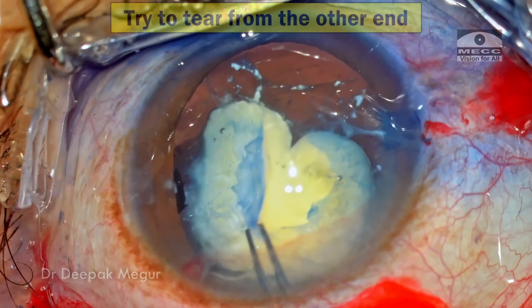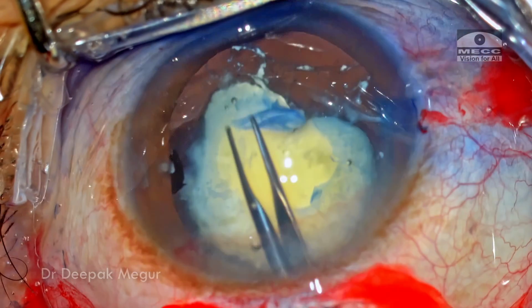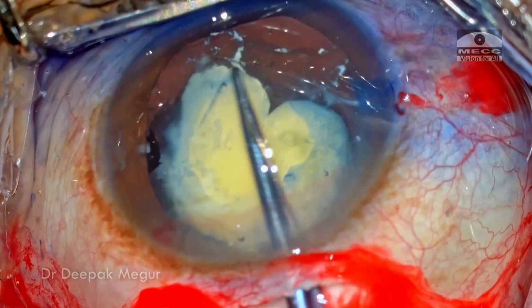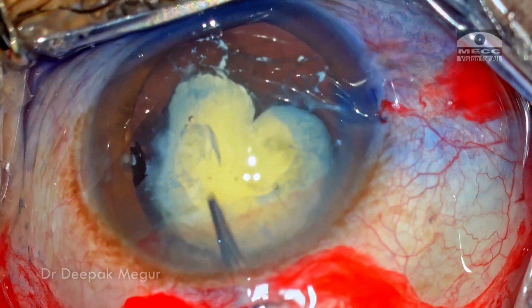So I try the usual trick, that is to try to complete the rhexis from the other end. Luckily, I could complete the initial smaller rhexis by tearing from this end. The remaining little flaps on either side are taken care of. Now it looks like a decent capsular opening.